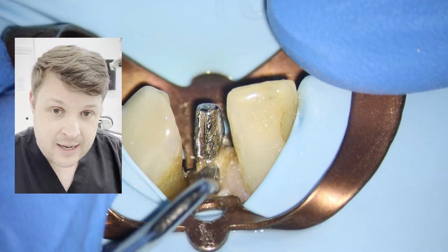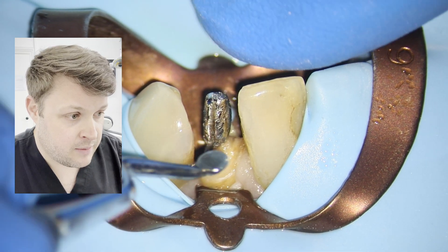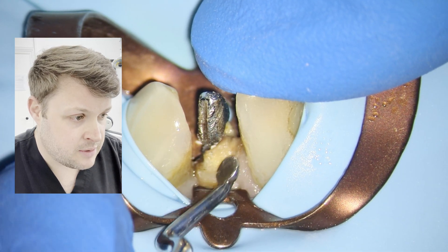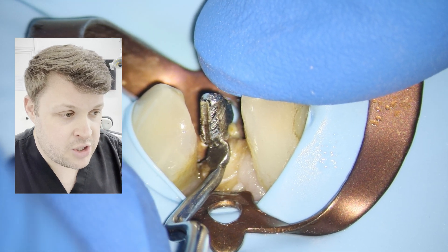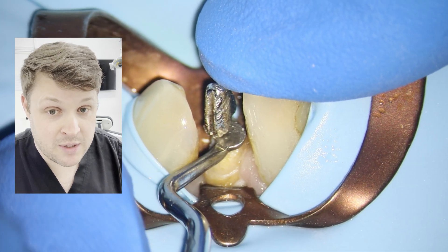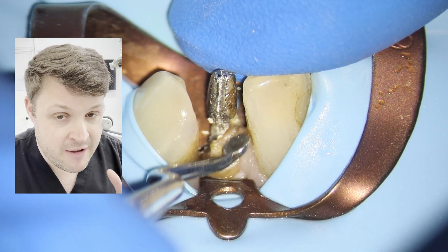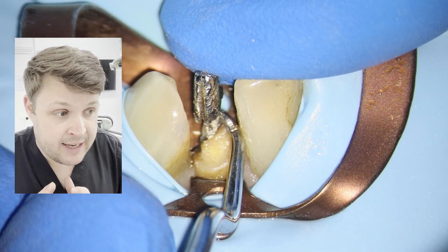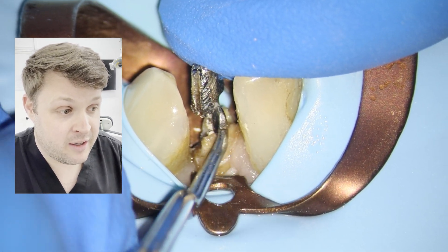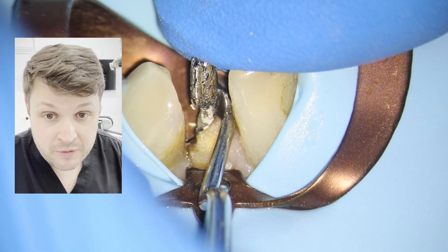I like to use an excavator to elevate the post out. As you can see now it's just starting to move out. You've got to be super careful you don't fracture the root doing this, because this is a very long post in a very narrow root. This is metal on tooth, and if you apply too much pressure you're going to break the tooth before you break the post.